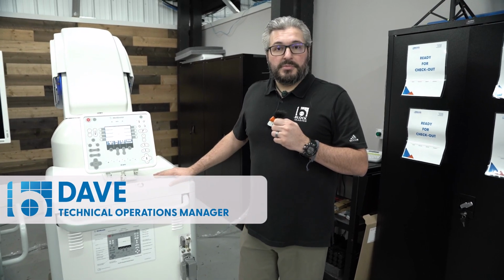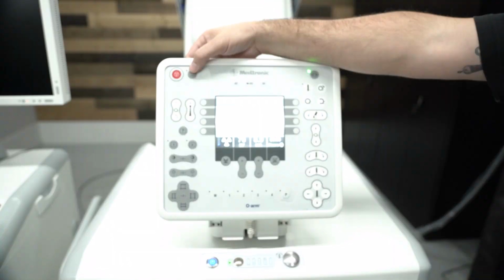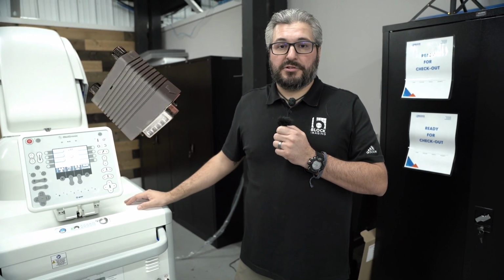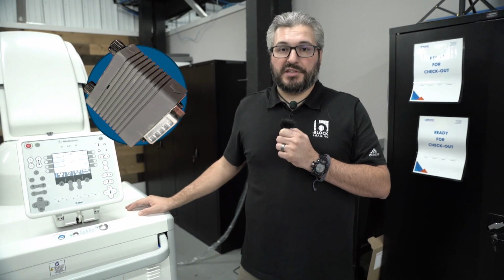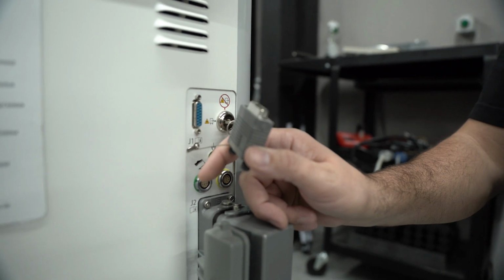A common problem on O-Arm systems is the E-stop gets triggered and you can't reset it. Why is that? 99% of the time, the problem is the external pendant jumper, and I can show you how to fix that.